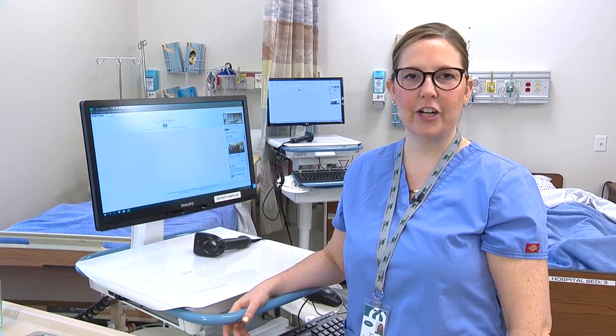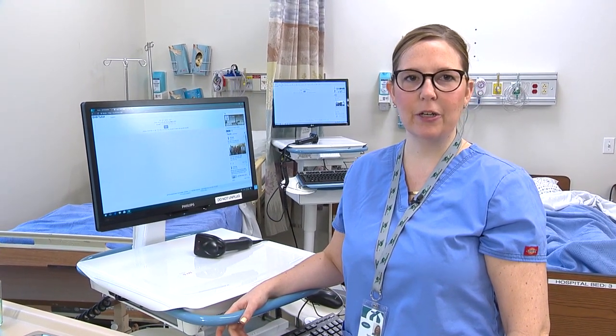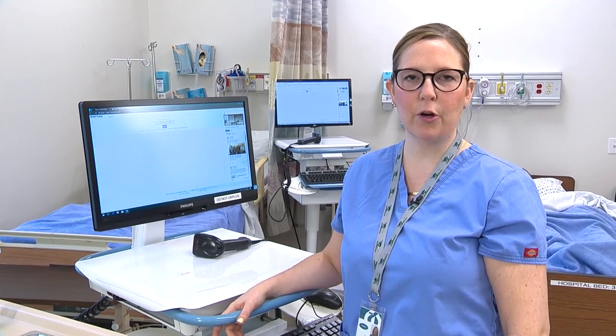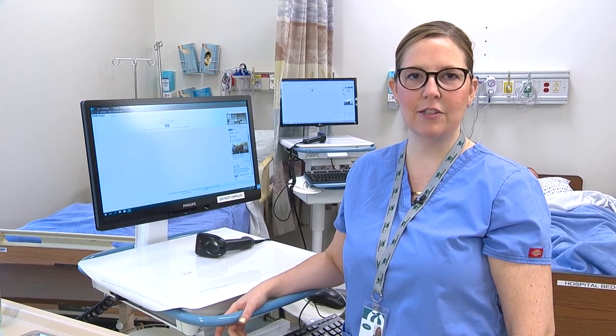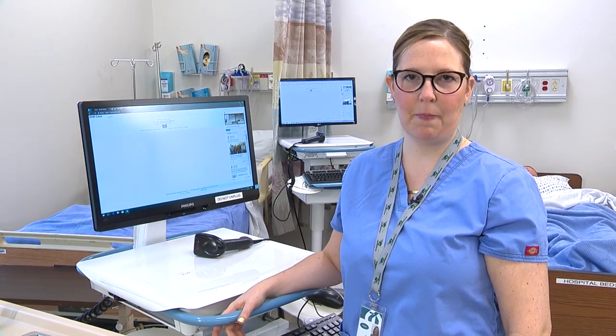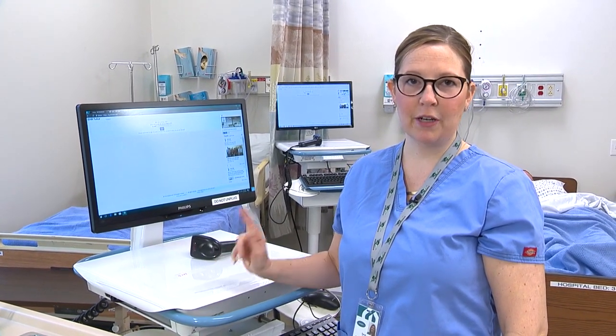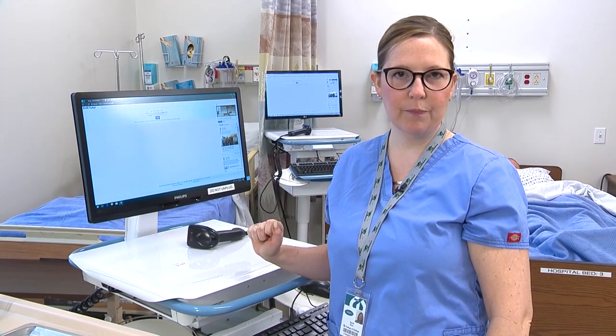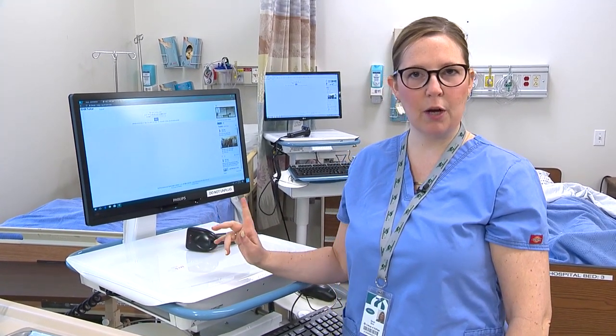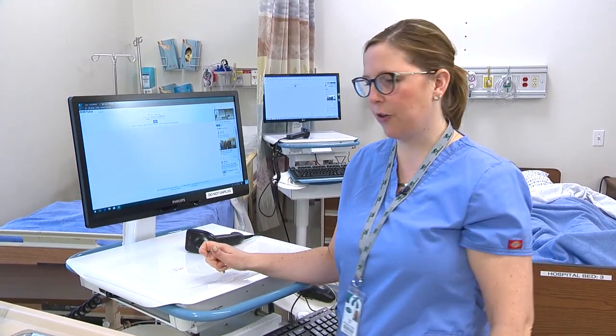Hi, I'm Sarah and today we are going to perform the skill of IM injection. I'm going to go over to the EHR and open up my patient's chart.